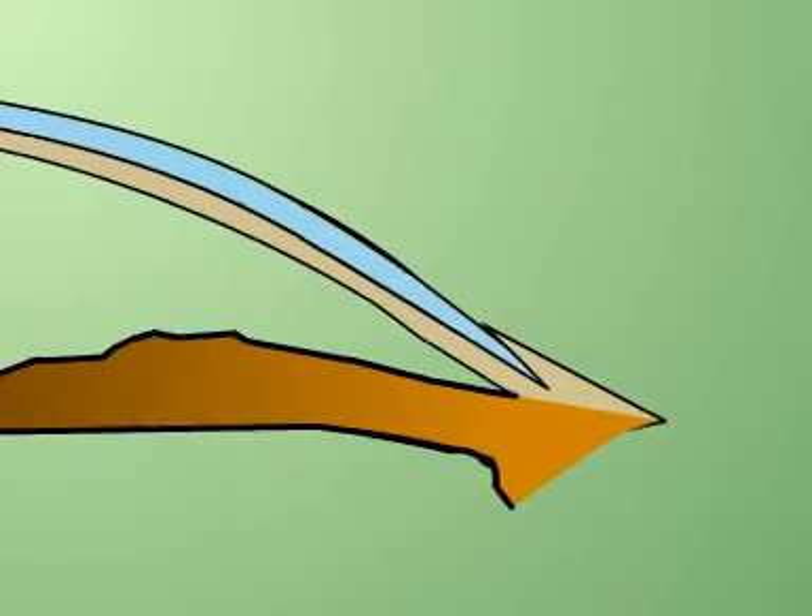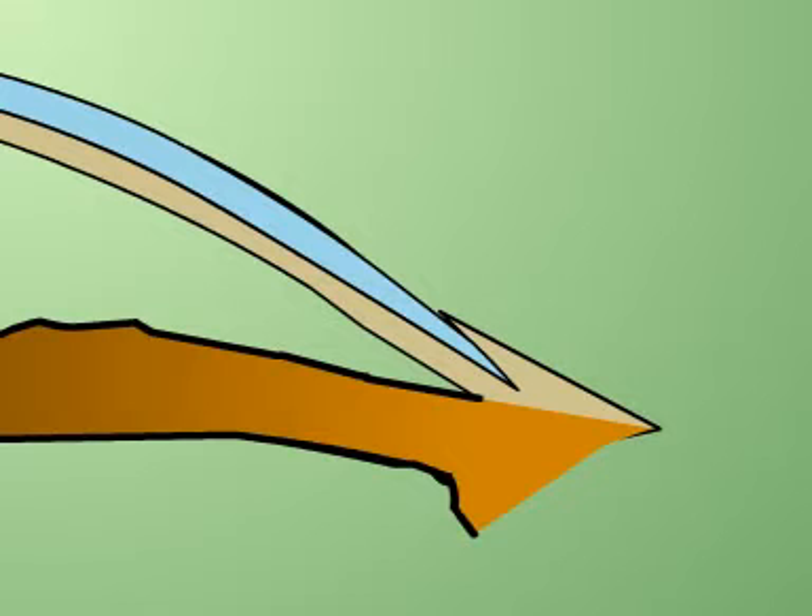It is important to note the path which the needle should take. The needle passes partial thickness through the graft and then into the peripheral pocket up to the limbus.